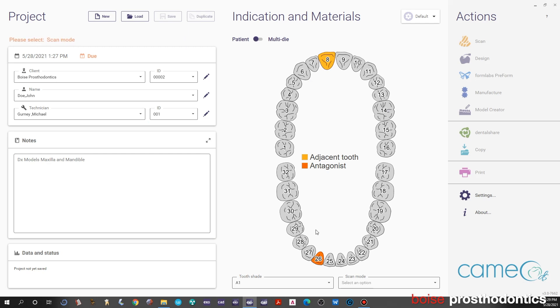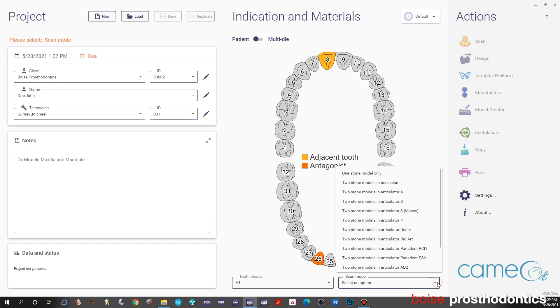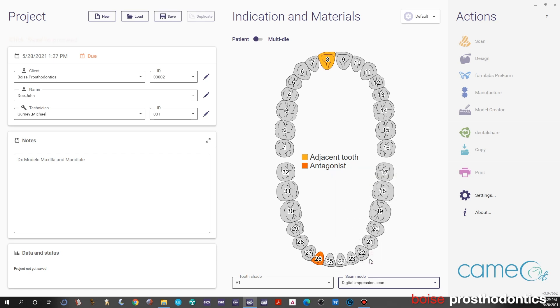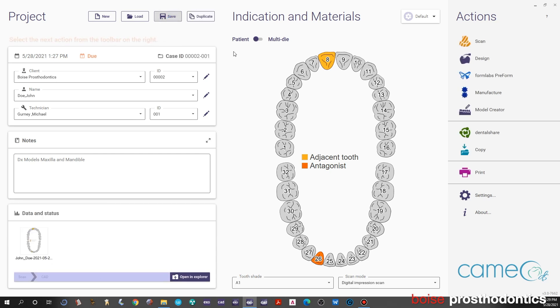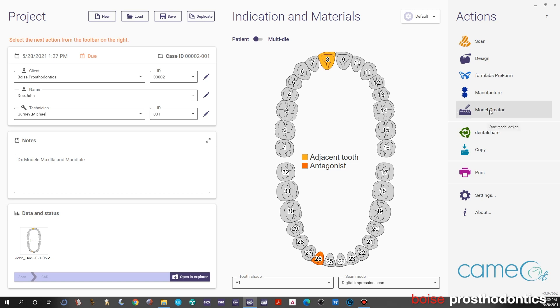Now we've told Exocad what we're going to do. At this point we need to define where we're going to gather the information from or the files. In scan mode we will select digital impression scans. Once we click on that we will then hit save, and once we have saved it we can then move on and open up the CAD software using the model creator module.